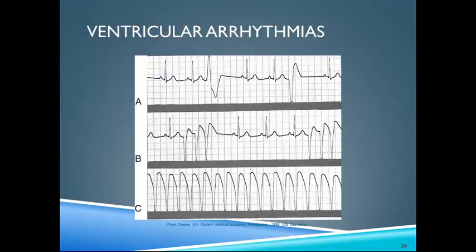B has a few ventricular tachycardia waves here, seen in threes. And C is a full-on stretch of ventricular tachycardia, where the ventricles beat at extremely rapid rates, which usually reflects a pathological state such as a coronary blockage. This can lead to cardiac arrest, unconsciousness, and death.